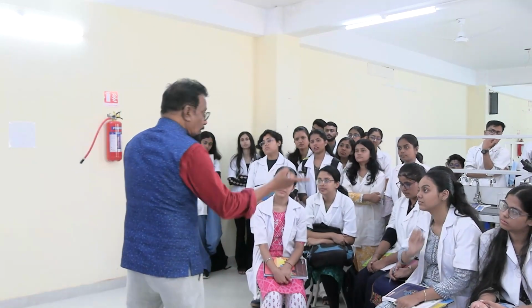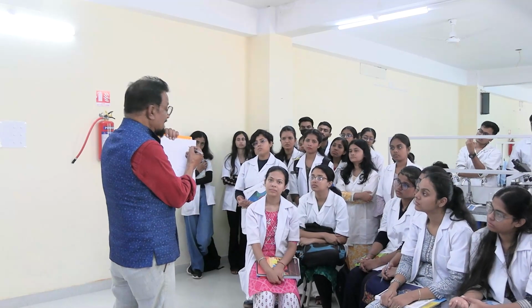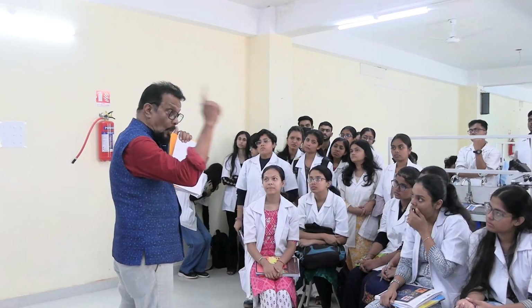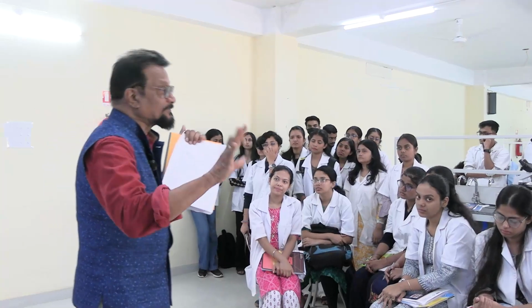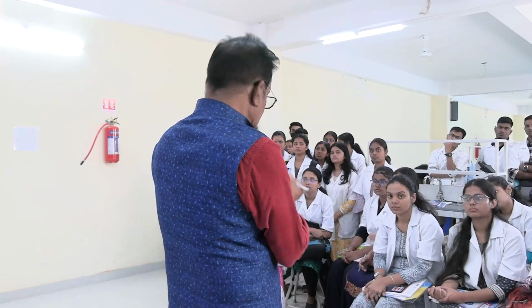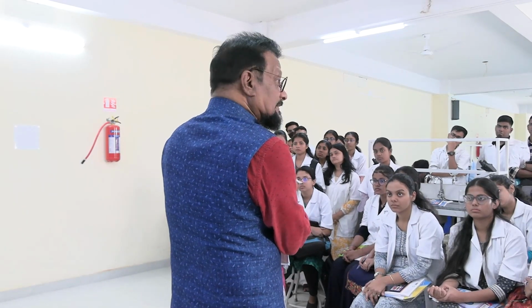Now out of this 100, how many neutrophils could you see? If it is 60, then it is 60%. If you identified only one basophil, or there may even be an absence of any basophil out of 100, then if you get one, it is 1%, and neutrophils 60%. And if you get 6 eosinophils, then it is 6%.